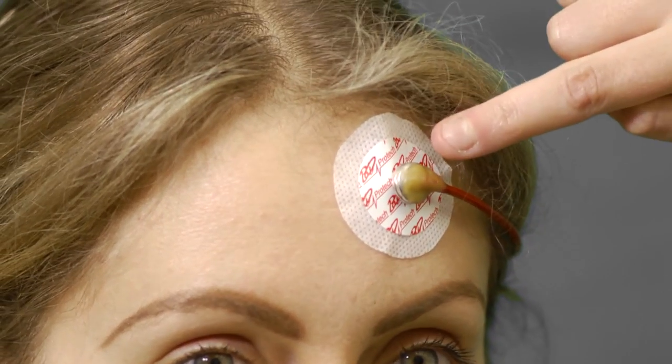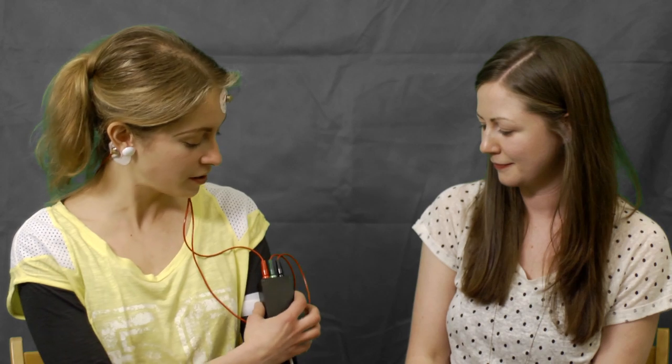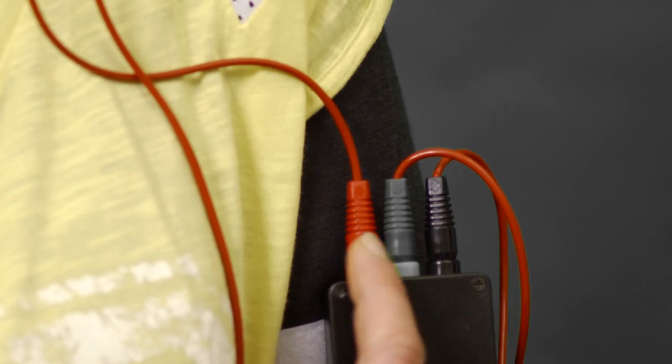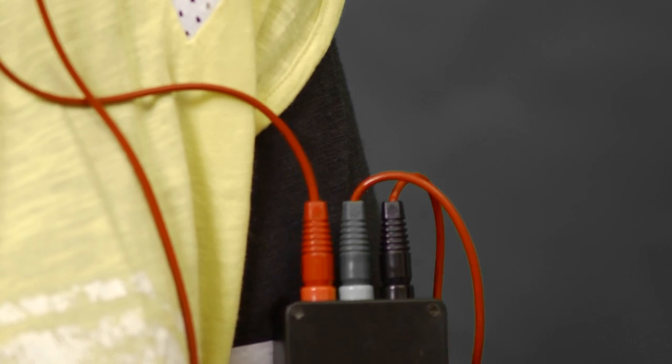Yeah, so today we're going to try and measure your EEG between FP1, which is located on your forehead on the left-hand side, and A1, which is on the mastoid behind your left ear. So we're just going to record the EEG between those two with our bioamplifier. Okay, and just to remind you that, again, we've got our differential amplifier here with its three inputs. The first one's a positive, negative and ground.